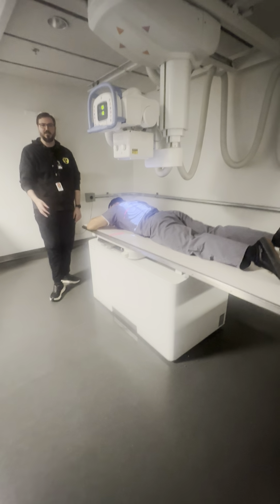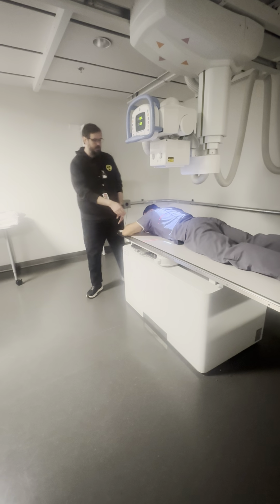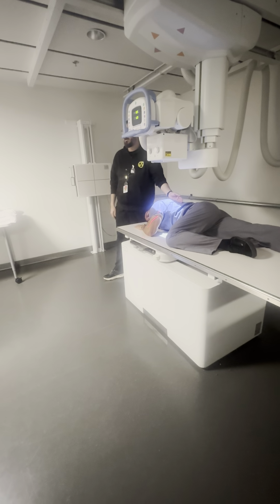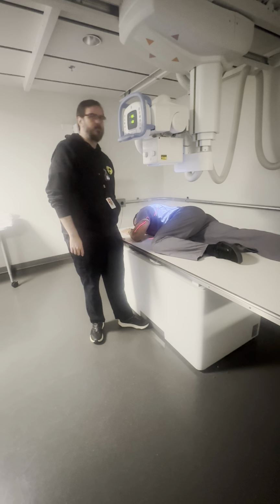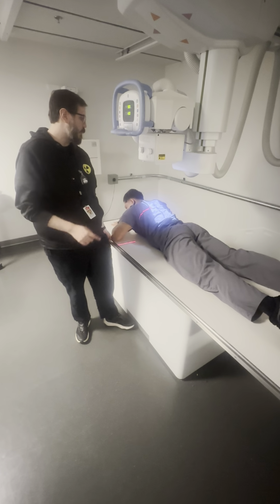The oblique is literally the exact same oblique we just did for the esophagus. Bend the right knee, or bend the left knee, bend the left elbow, come in here, half of the half, but you shoot right there. It's the exact same shot, right? There you go. There's your UGI. Go back flat for me for a minute. But we have another shot here.